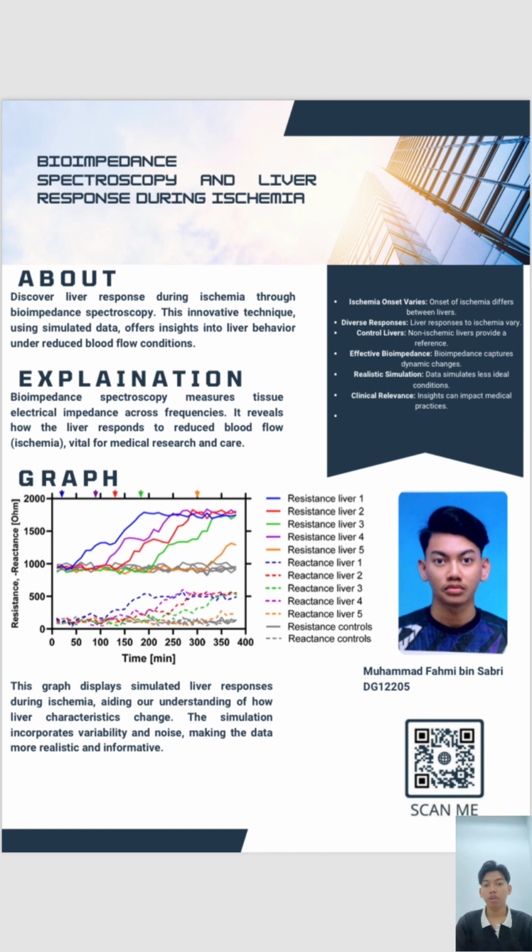BIS is non-invasive, relatively inexpensive, and can be used to obtain real-time measurements. This makes it a potential tool for use in clinical settings to monitor patients at risk of liver ischemia.